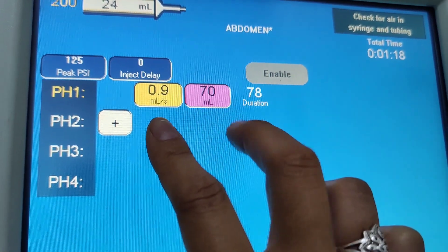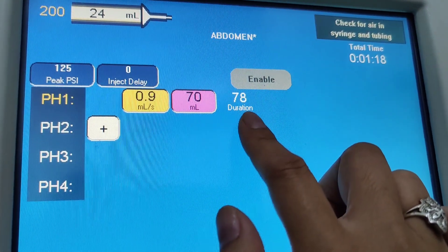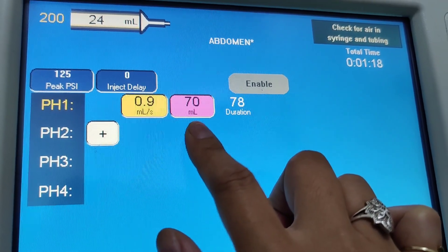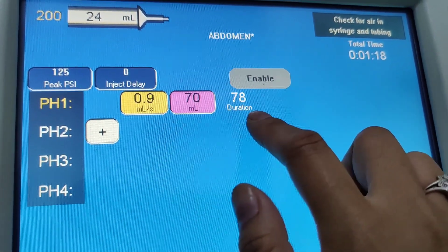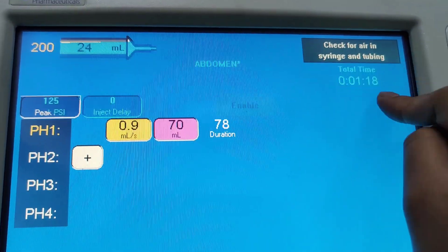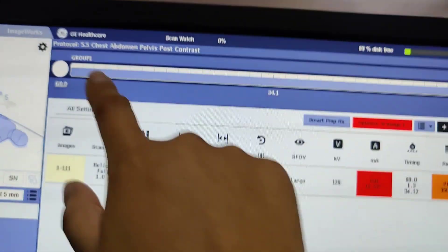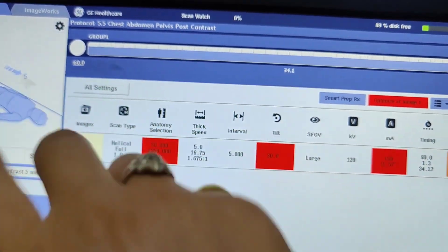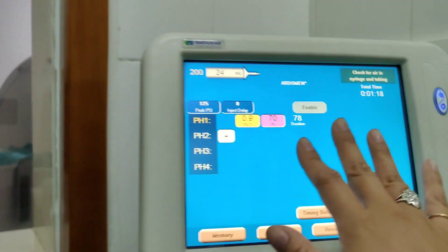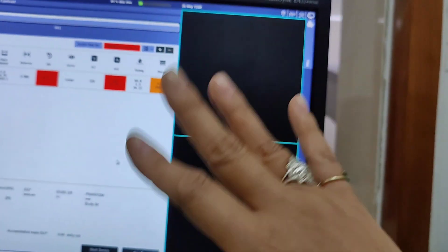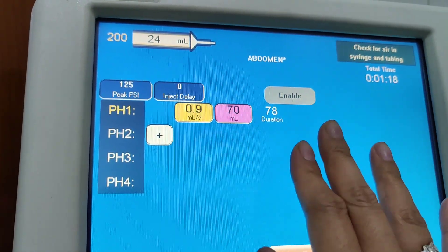If I leave that there, it's going to be too long. At that amount of contrast and that flow rate, it's showing 78 seconds — which is 1 minute and 18 seconds — and that's too long because our scan time is going to finish at 60 seconds. So if you push go on the CT machine and go on this at the same time, the scan will already be done before the contrast finishes. This means we're too slow.